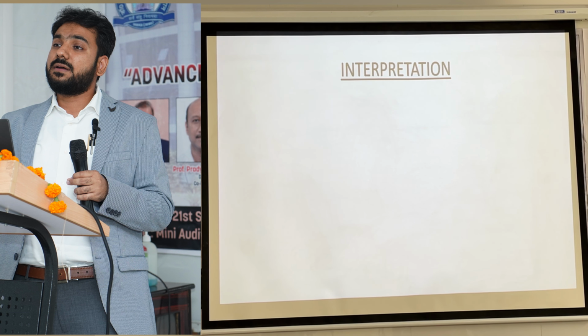The first thing is to look at spirometry. That I think is the first step. You should not go back. You are looking at DLCO and then suspecting what it might be. No. Always look at spirometry first. Better to look at the body box then, and then look at DLCO. That will be the correct way. That will help you in reaching a diagnosis rather than looking at DLCO and suspecting what it might be. So the better way, and obviously you should tell the patient to perform spirometry first, then you should go with DLCO. So that is the first step.